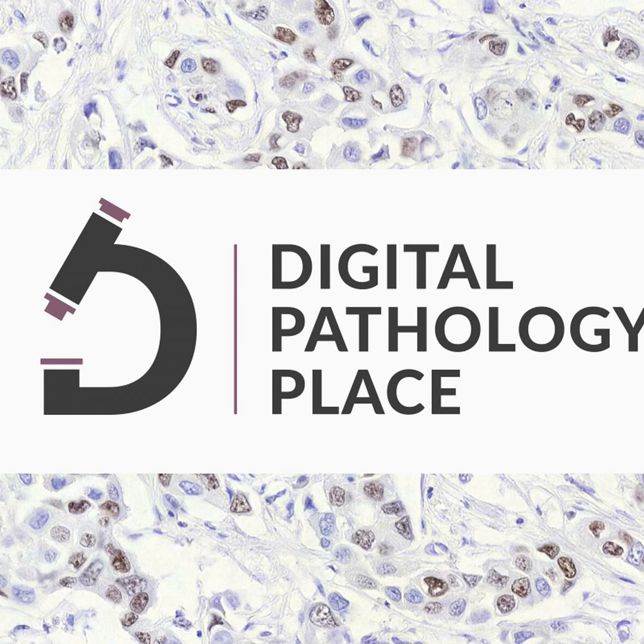What an attention mechanism does is it essentially looks at the features coming from each patch, and based on these features determines whether this patch is important for classification or not. It gives it a value between 0 and 1, where 0 is not important at all and 1 is very important. And that way you can actually only use the parts of the image that are relevant.